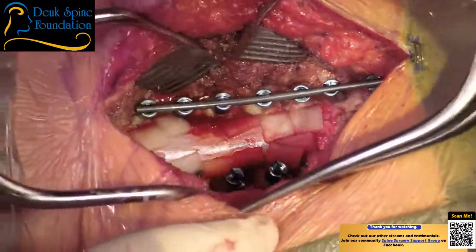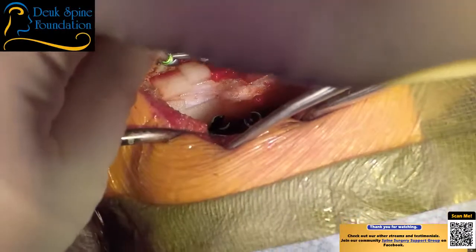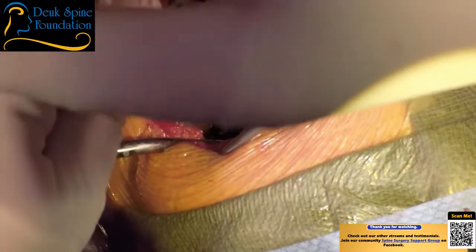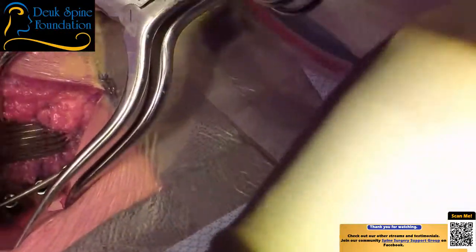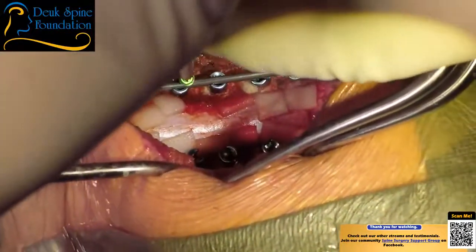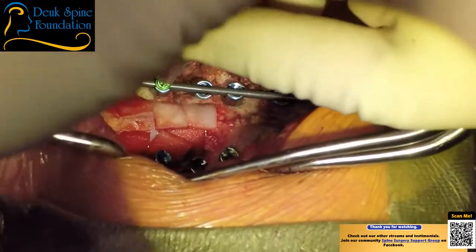It looks good. Yeah. So now we're going to put set screws in. Yeah, take down the facets with a drill, after the rod is placed. Everyone does this differently. You're right. Thank you for asking.